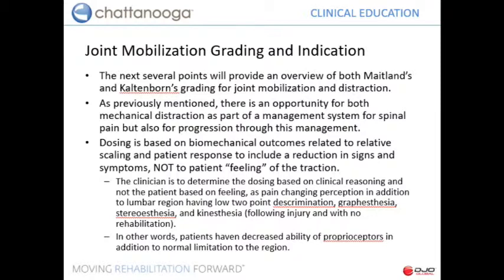But you must also consider the other components, which is the duration of the hold patterns in intermittent, even the duration of the hold pattern in static, but the speed of the transition, as well as the overall amount of force that you're actually using. So in essence, when we think about why choose one pattern over the other, it goes back again to the same reason of why you may be using a specific term in mobilization, and now we're just able to use it from a mechanical standpoint.